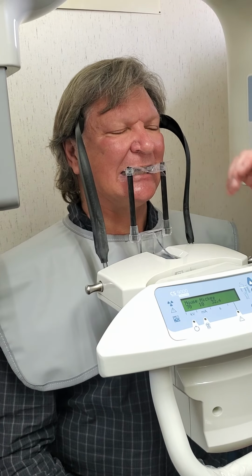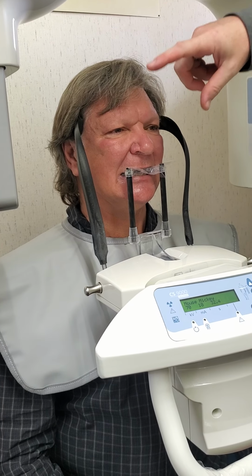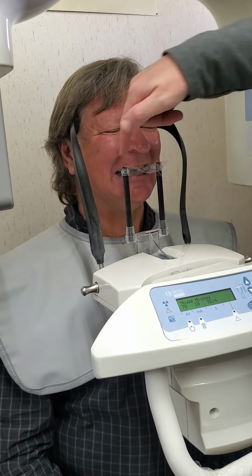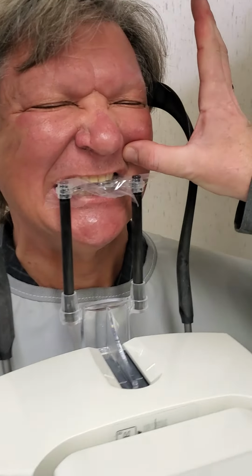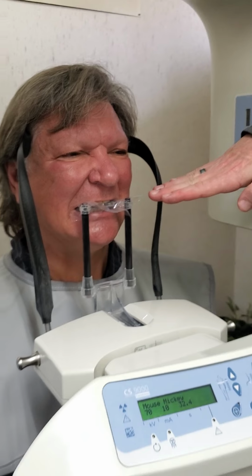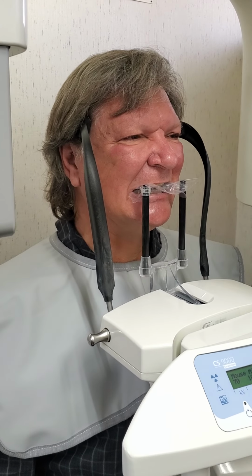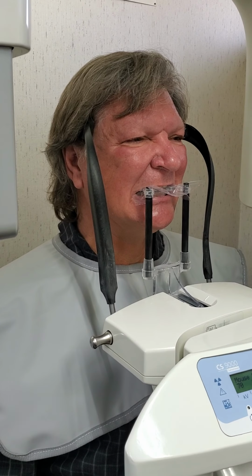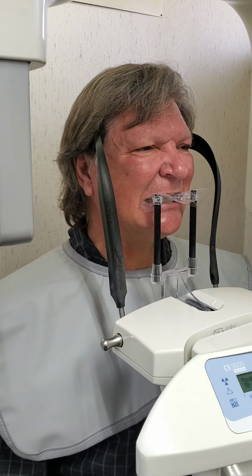Yeah. And if you look and you have them smile as big as they can. Go ahead and smile. And you can see now that the plane of the teeth is parallel to the floor. Okay. But if you look at the bottom teeth, they're not. So there'll be a different adjustment, top and bottom. It has to be positioned just a little bit different.